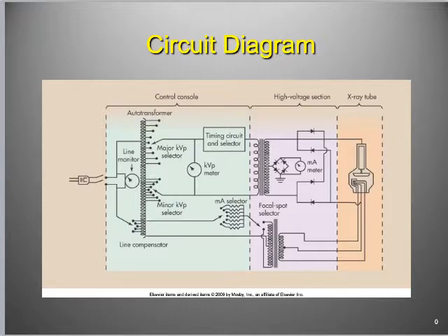And if you remember, the amps are a measure of current, right? It's how much water's flowing through the garden hose, right? So I've just said we kind of reduced the pressure while increasing the flow, right?